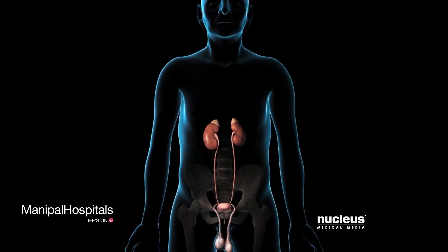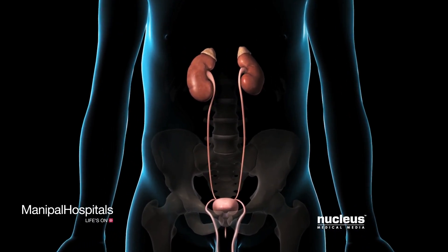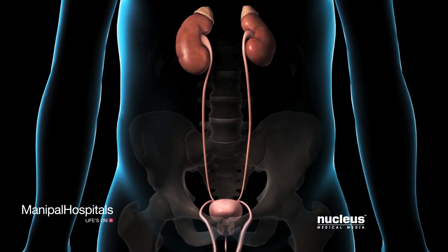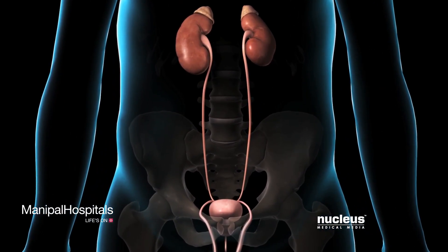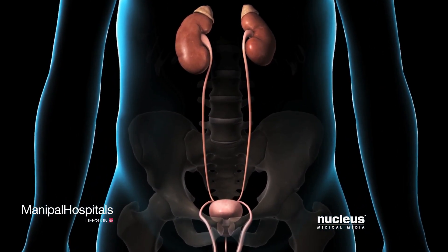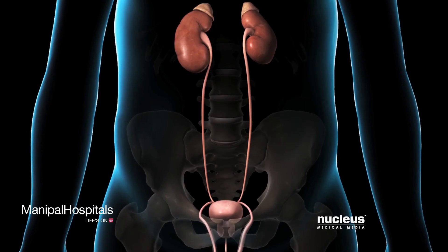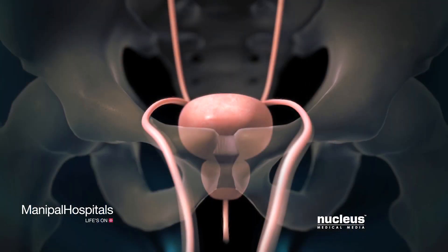If you are a man and have bladder cancer, your doctor may recommend a robotic radical cystectomy to remove your bladder and prostate gland.